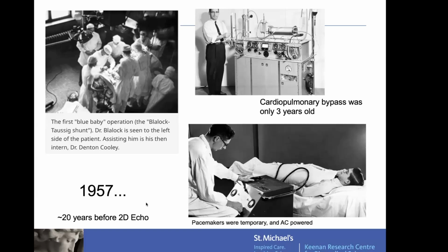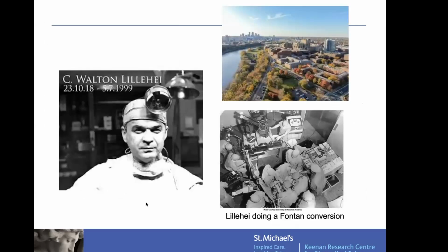They were AC powered. You had to plug them into the wall, and they were obviously not intended to be a long-term treatment solution. They were temporary, and used for things like postoperative heart block, particularly in pediatric surgeries. This is a famous cardiac surgeon at the time, Dr. Lillehei, who was practicing out of Minneapolis, routinely doing these corrective surgeries in pediatric patients and then taking care of them post-operatively.